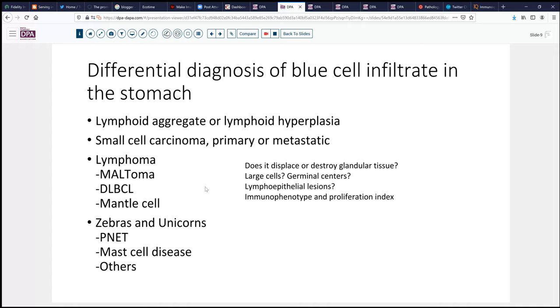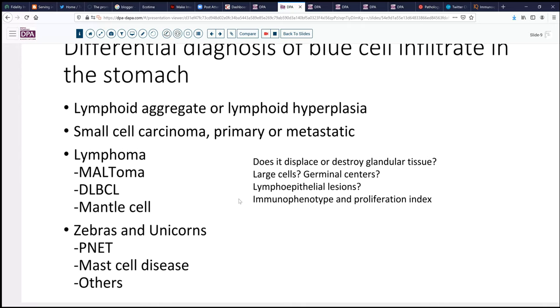In looking at lymphoma, there are important questions to help you begin to think through the diagnosis. Does this displace and destroy glandular tissue? That can help differentiate hyperplasia from lymphoma. Are the cells large or small? Is there germinal center formation? Do we see lymphoepithelial lesions? These generally favor lower-grade lesions. And then we can go to the immunophenotype and think about the proliferation index.